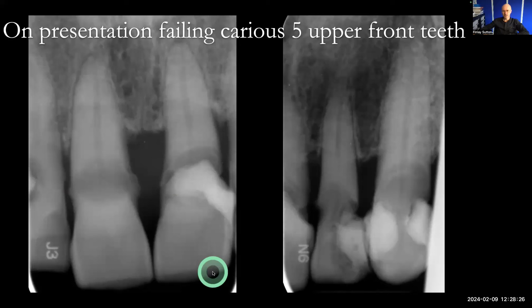The upper teeth were theoretically restorable, but in clinical practice I don't think they were really worth keeping, even though I love natural teeth. So we decided to extract them. The treatment approach was to add onto his existing old partial denture as a temporary measure — adding those five upper front teeth — and then make the upper and lower complete metal-based dentures straight away. Then between nine and twelve months after extracting the teeth, reline the upper denture.